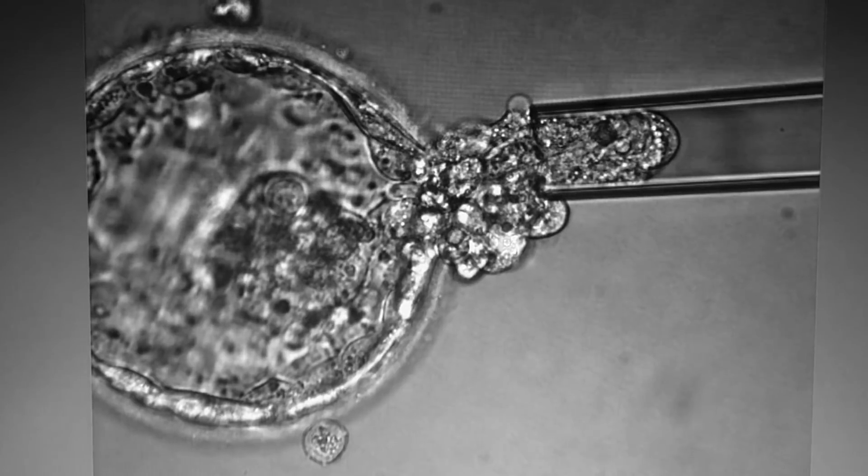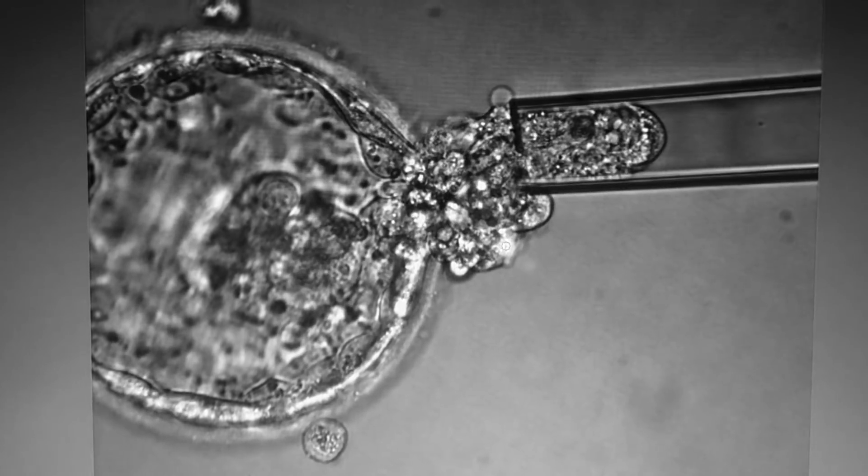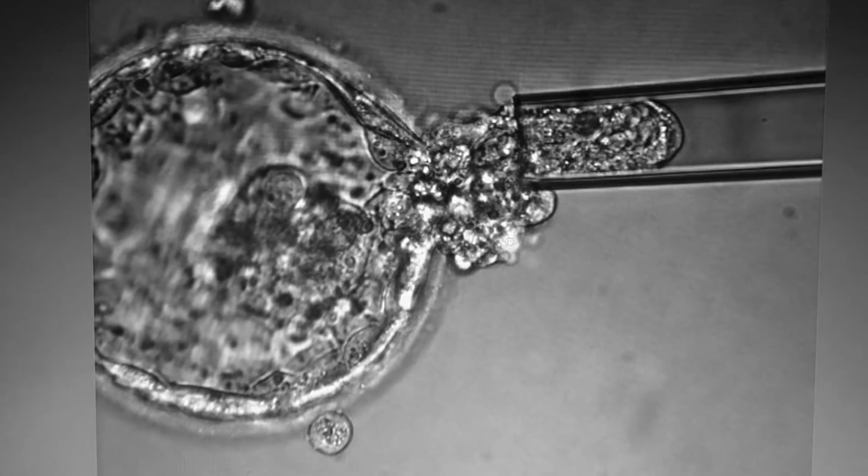You can see here that the laser is being applied over the hatched cells so that these cells can be separated from the rest of the blastocyst.